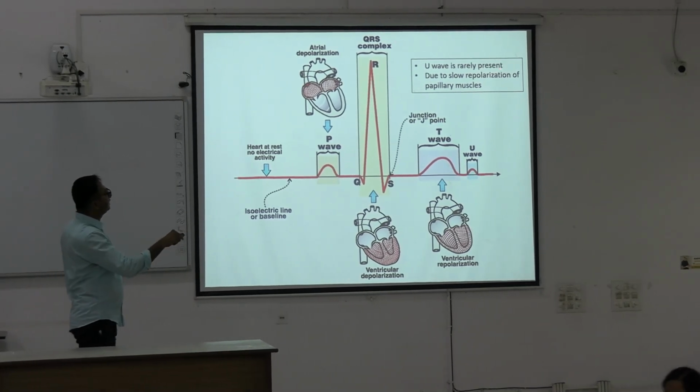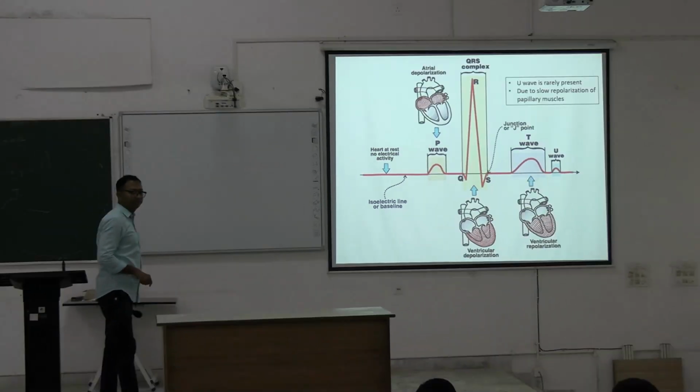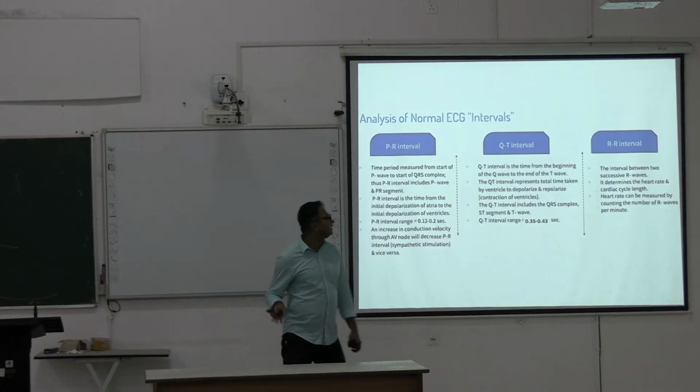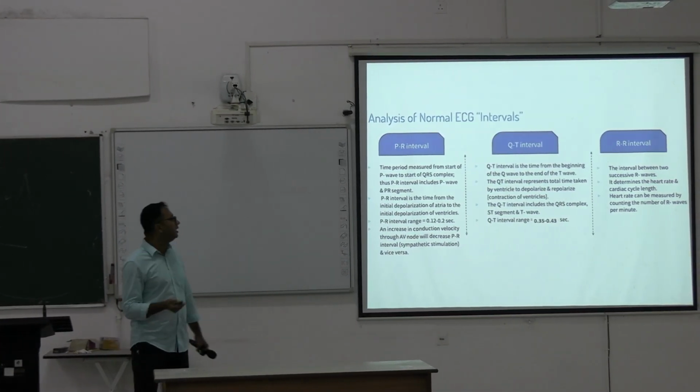Yes, U wave is rarely present. It is due to slow repolarization of papillary muscle. Okay, we will discuss all the intervals, the PR interval, QT interval, RR interval.